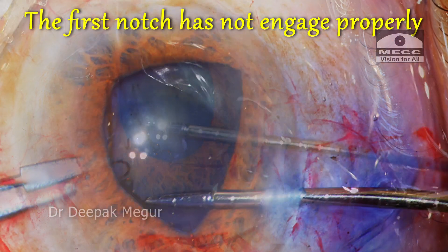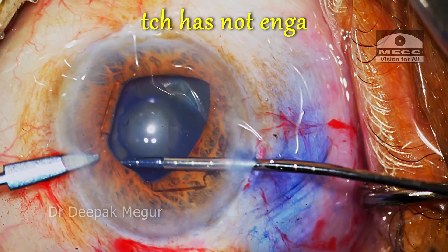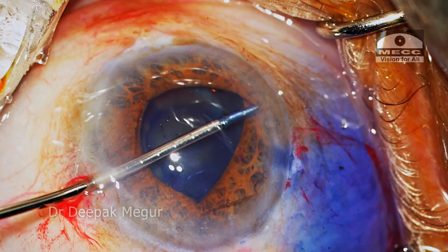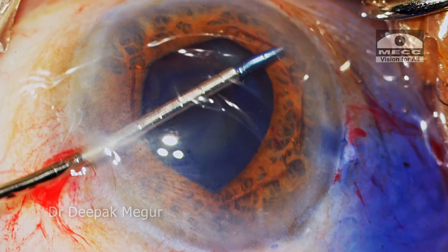The first notch has not engaged well enough, so it is repositioned before engaging the final pair of notches onto the iris.